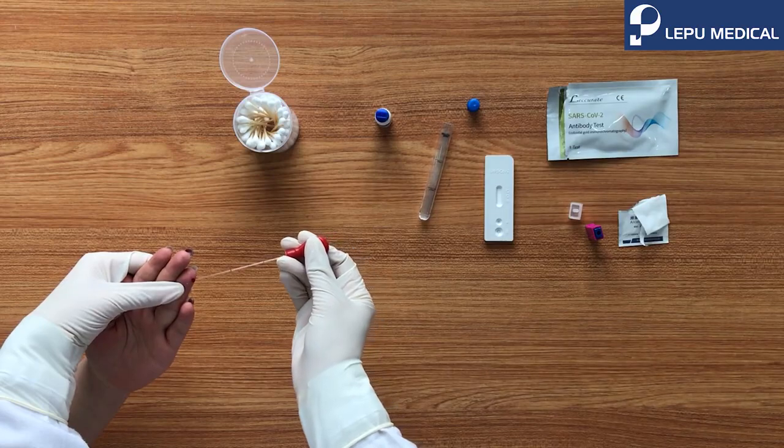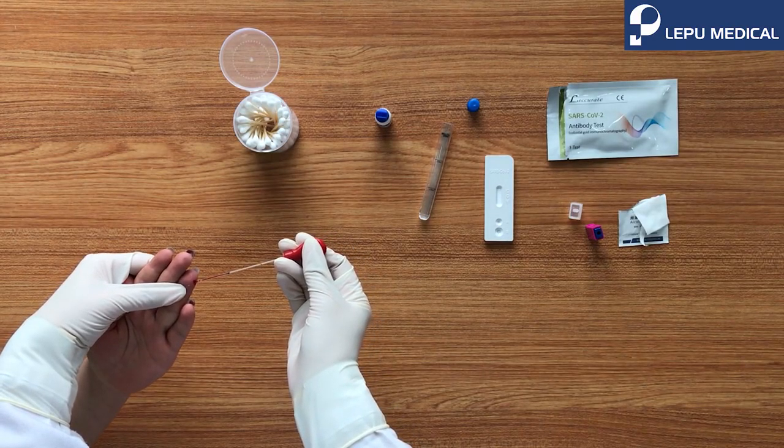Use the dropper to collect 20 microliter blood and add to the sample well A.